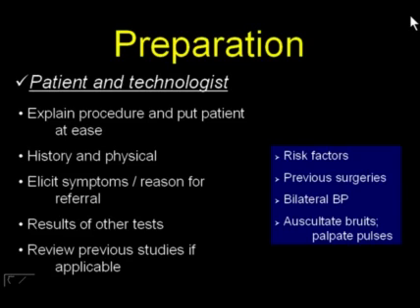We may or may not perform a brachial artery blood pressure. We do not happen to do that routinely. I know there are some laboratories that do that. We have an algorithm in place that calls for the performance of a bilateral brachial artery blood pressure. And of course, any patient who presents with symptoms referable to the posterior circulation, or any patient that's referred for asymmetric bilateral blood pressures, would get an evaluation in our lab and also get an evaluation of the bilateral subclavian arteries as well.